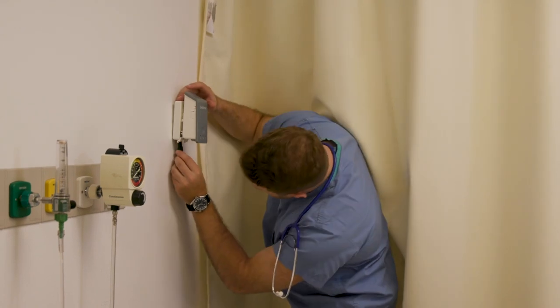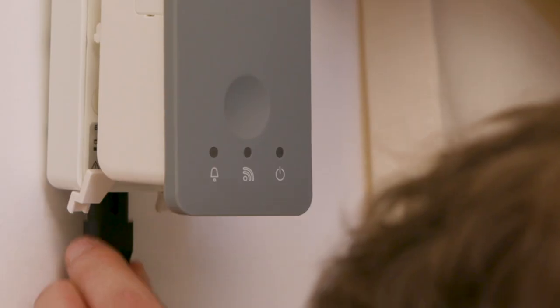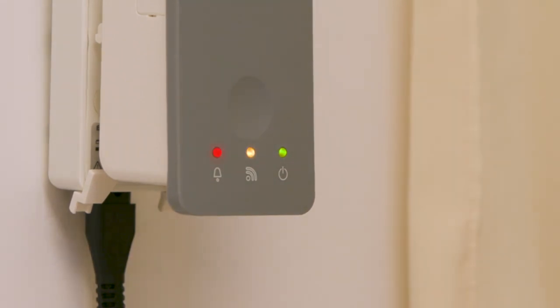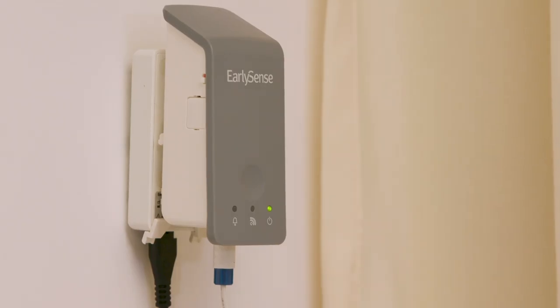Connect the cradle's power plug to an available outlet. The three indicator lights on the InSight device will show flicking colors. After the EarlySense application is successfully running, the power LED will show a green light.